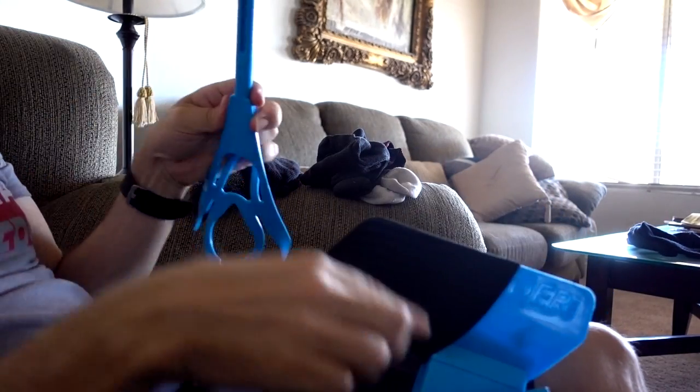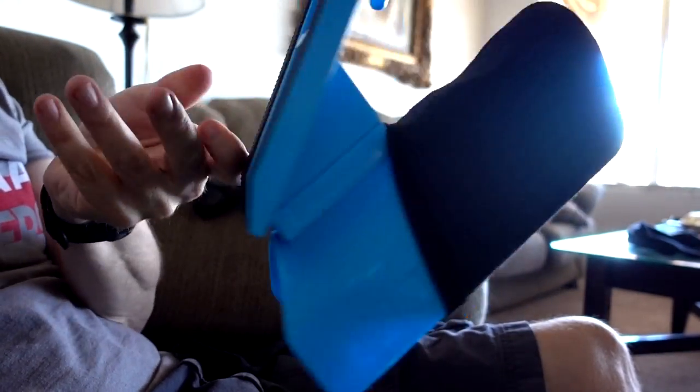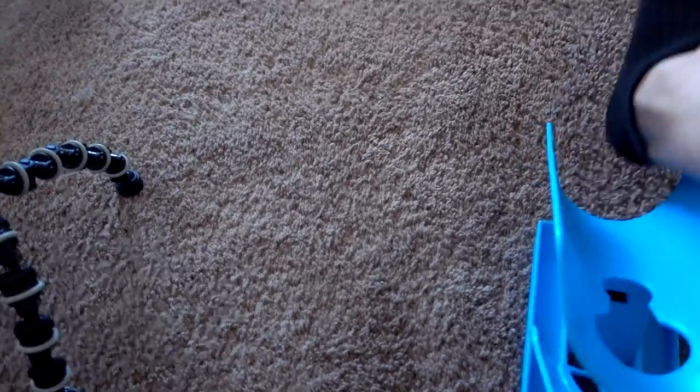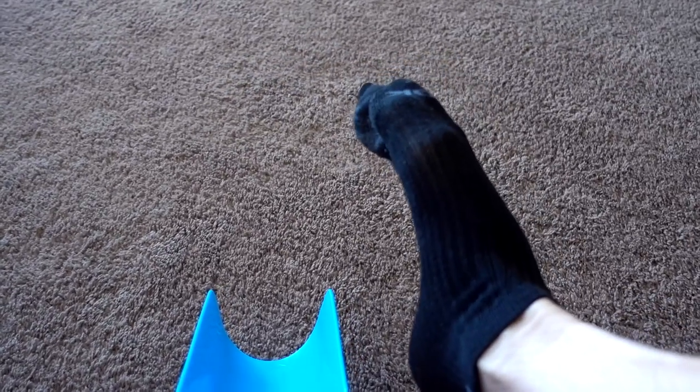Then you take the handle and lower it down to the floor. Then what you're supposed to do is put your foot in there. Maybe not — let me try that again.